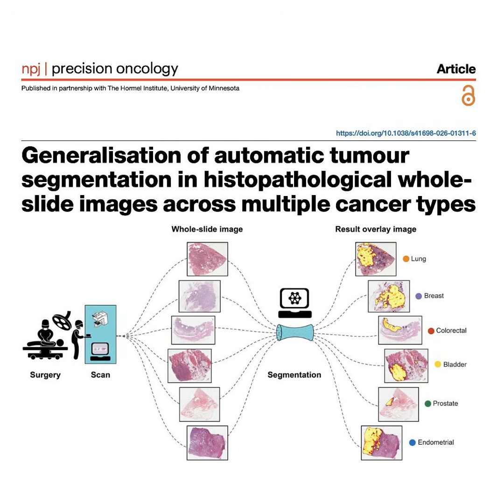How so? Well, historically, AI in medicine has been heavily siloed. Like, you build an algorithm to find lung cancer, and it becomes an absolute expert in lung tissue. Right. But if you show that exact same AI a slide of prostate cancer, it is completely blind. Wow. Yeah, the architecture simply doesn't know what to look for outside of its highly specific training environment.